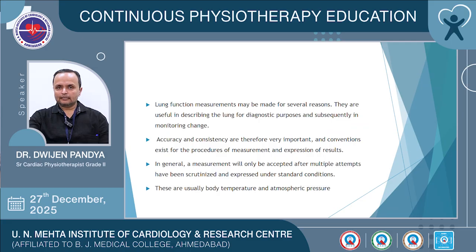Lung function measurements are made for several reasons. They are useful in describing the lungs for diagnostic purpose and in subsequently monitoring change. So accuracy and consistency are therefore very important, and conventions exist for the procedures of measurement and expression of results. There are standardized procedures for measurement of the lung function which have to be followed.